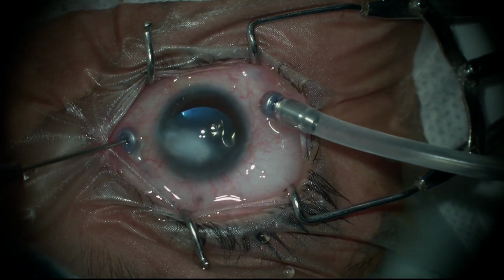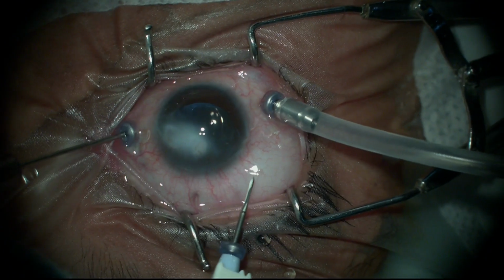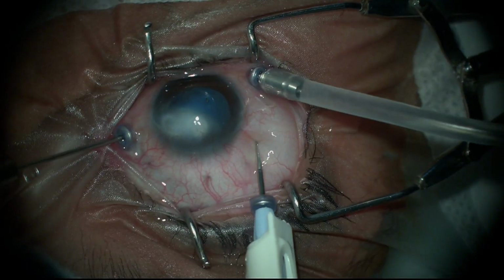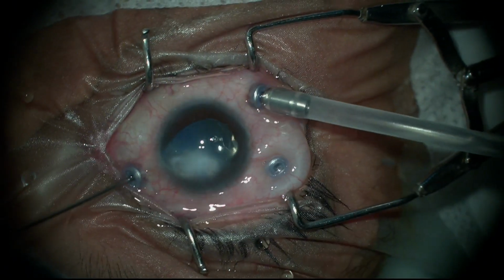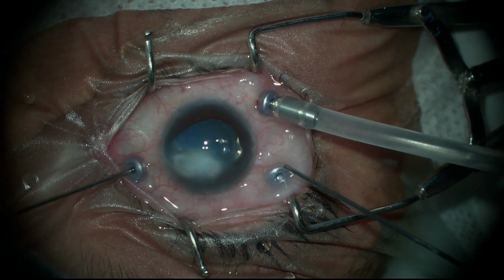These are very good trocars. Yes. They're very sharp. But sharp की अपनी एक प्रॉब्लम. TMA चाहिए. If they are very sharp, then you have a premature entry.